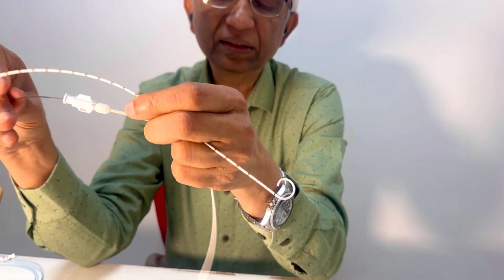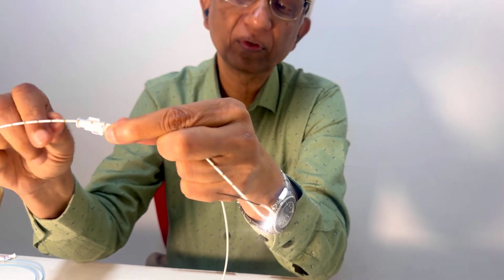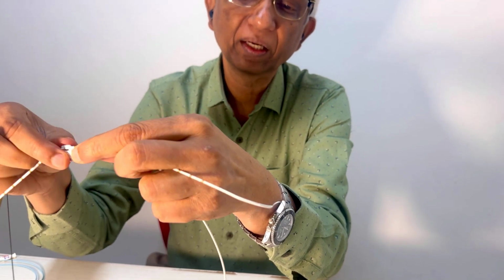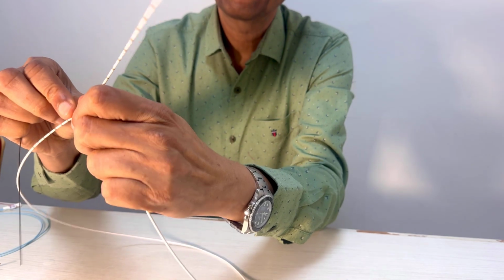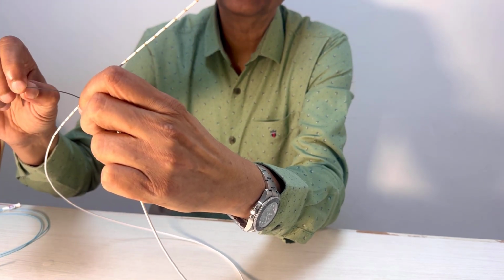This catheter is just kind of unfolding, and as you push it forward, you will find that it actually becomes like this, right? Have you got it? Now imagine if you rotate it round in this position, this is how you're keeping your catheter. It is opening, and it flips into the descending aorta. Have you got the shape, right?